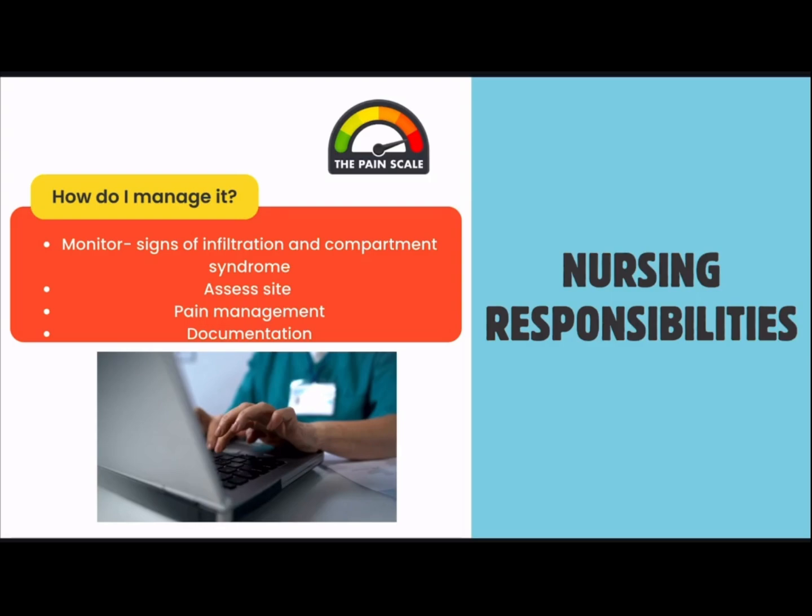So again, we're going to assess the site in conjunction with our monitoring. We also really want to advocate for our patient and provide pain management. This is not a comfortable procedure. If your patient is awake, the actual drilling itself is reported to not be horrible. It's when you go to infuse something through it that's very uncomfortable. So again, follow your site's policy and procedure, but many providers are going to order some sort of intraosseous pain medication, or you can even instill some lidocaine in there that will help numb it and make it a little more bearable for the patient.